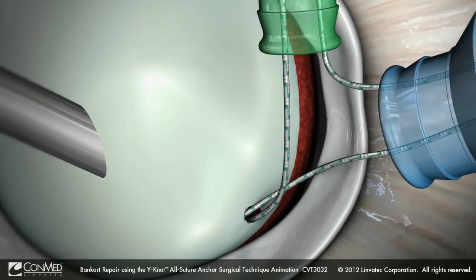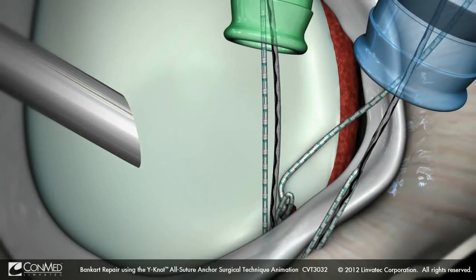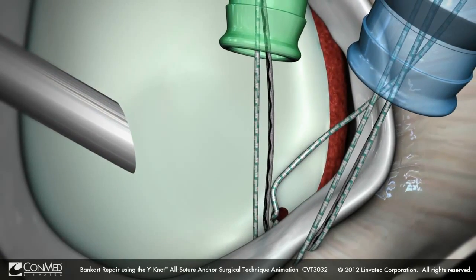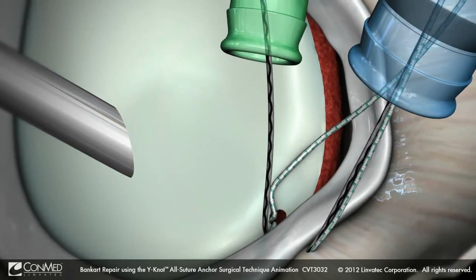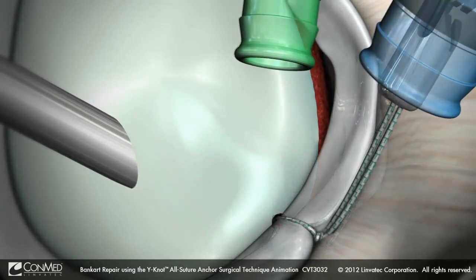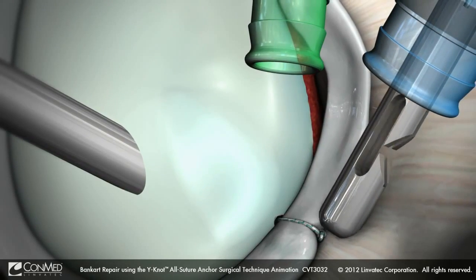Retrieve a suture limb through the anterior superior portal, and use the appropriate spectrum suture hook to shuttle the appropriate limb of suture through the capsule and under the anterior inferior labrum. Tie desired arthroscopic knots and cut excess suture.